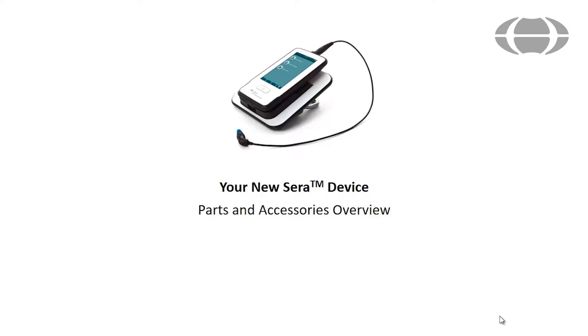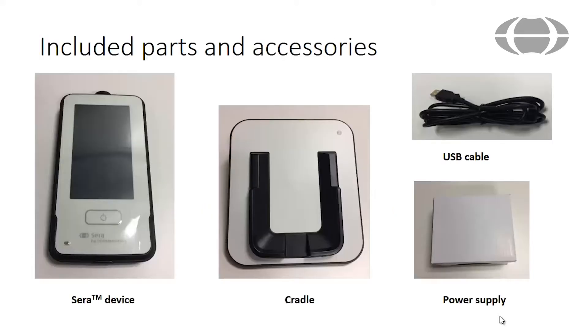This video will introduce you to the parts and accessories that come with your Sera newborn hearing screening device. Inside the box you will find the following included parts: the Sera handheld device, a cradle with power supply which is used for charging the Sera device, and a USB cable that is used for connecting the Sera device to the HearSim software for device and patient management.